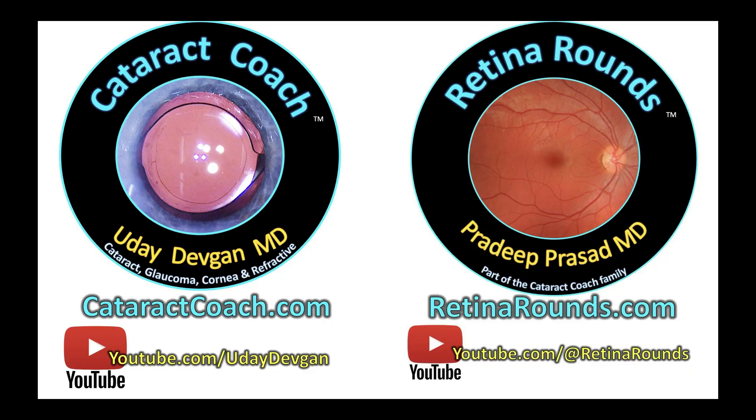Beautiful job. Now you know how to save your rhexis. And if you want to learn more, remember cataractcoach.com — you can submit your video too. Just follow the directions. Thanks.